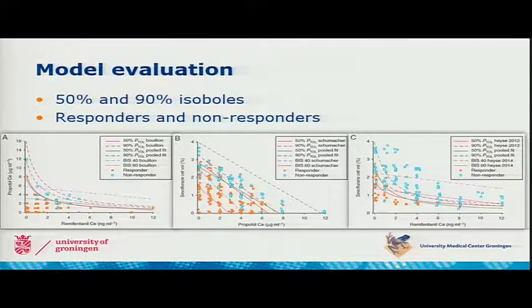So those of you familiar with 2-drug interaction models might be expecting a nice 3-dimensional response surface model, but I'm simply not clever enough to create 4-dimensional response surface models on a 2-dimensional screen. So we're going to have to do with separate 2D graphs of isoboles. And somewhere I think physics may also play a role in me not being able to do that.